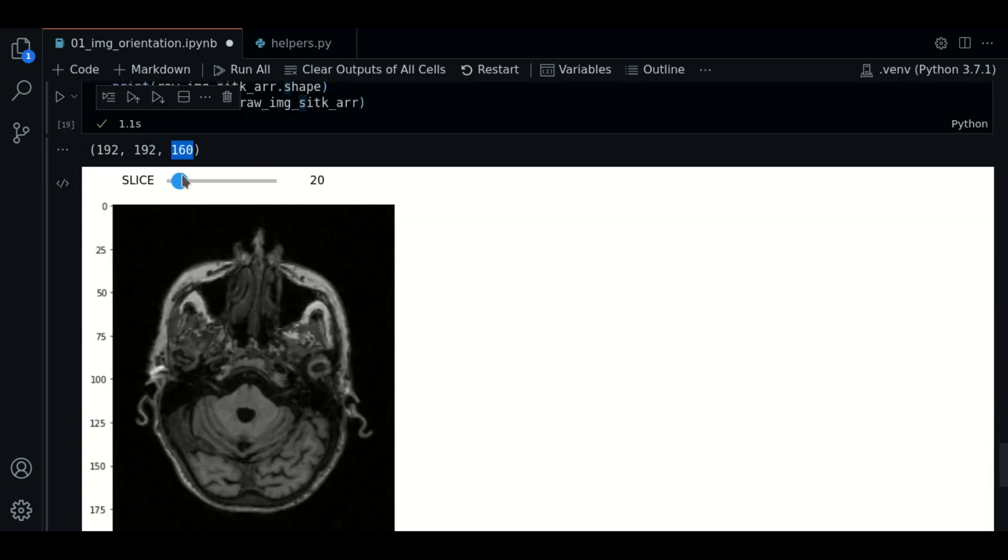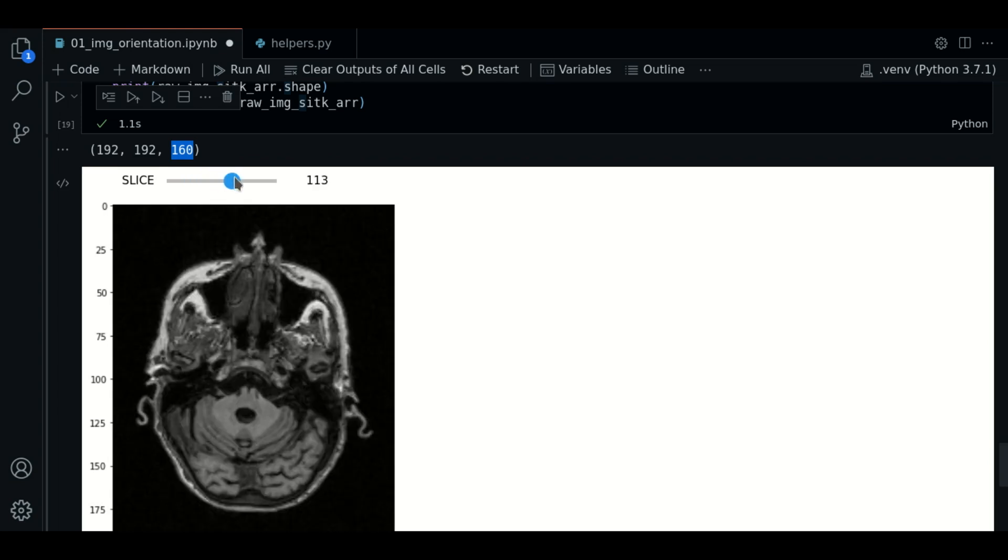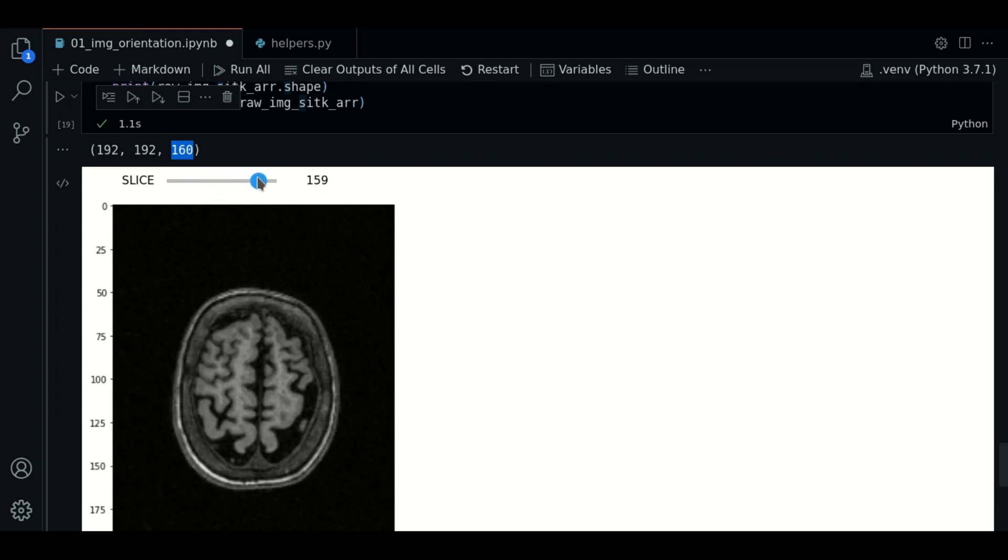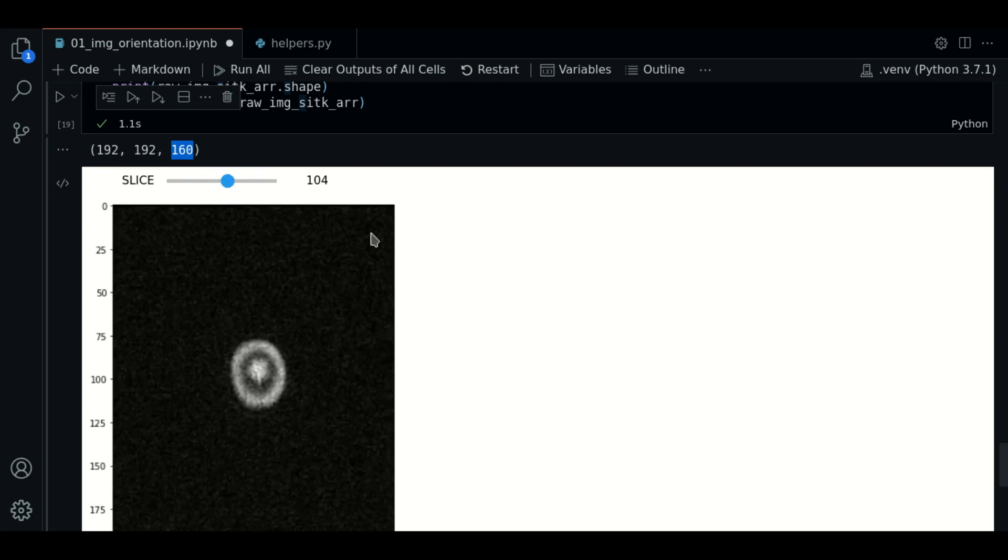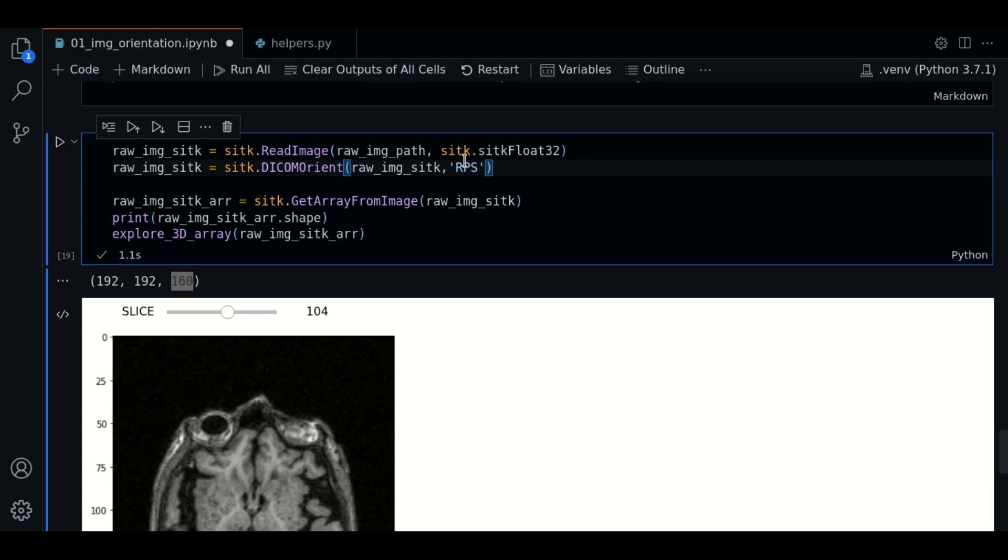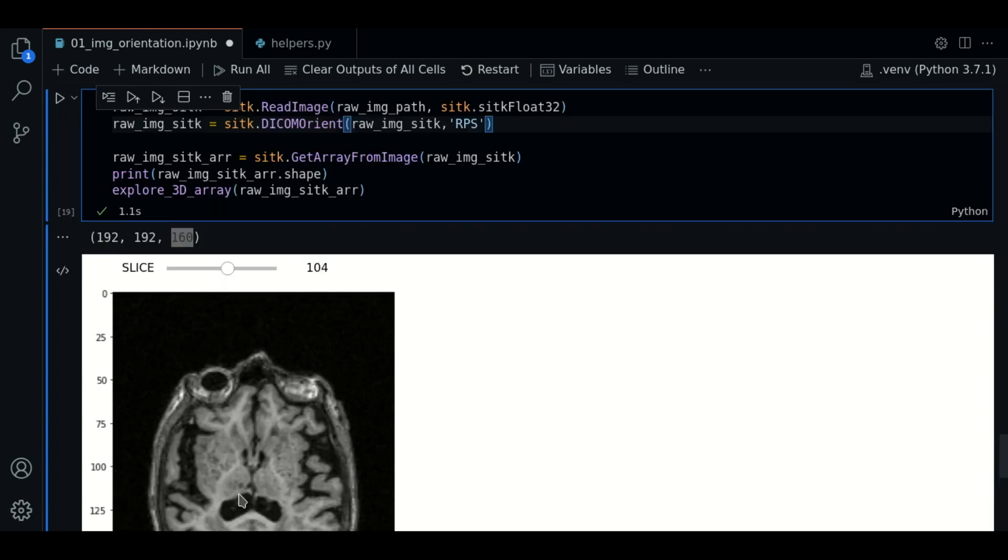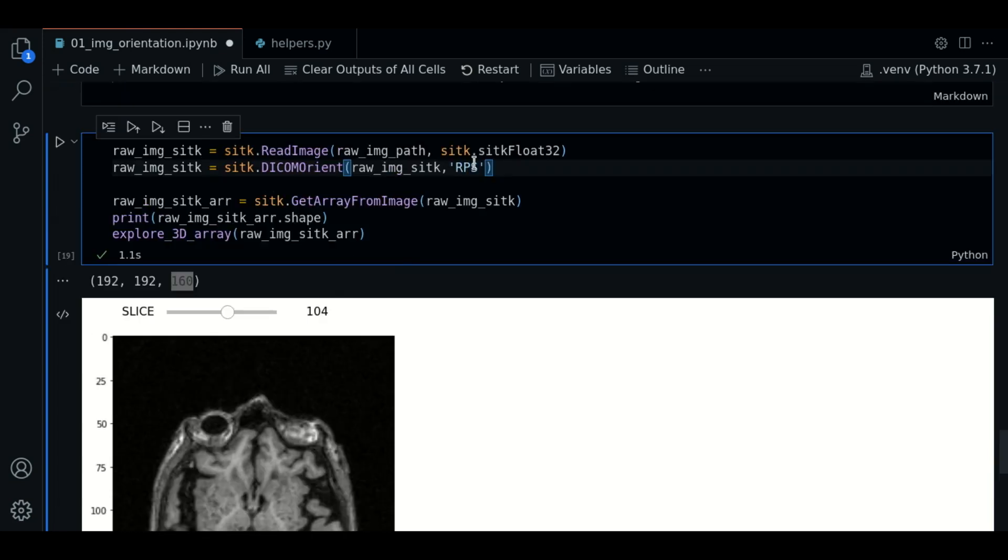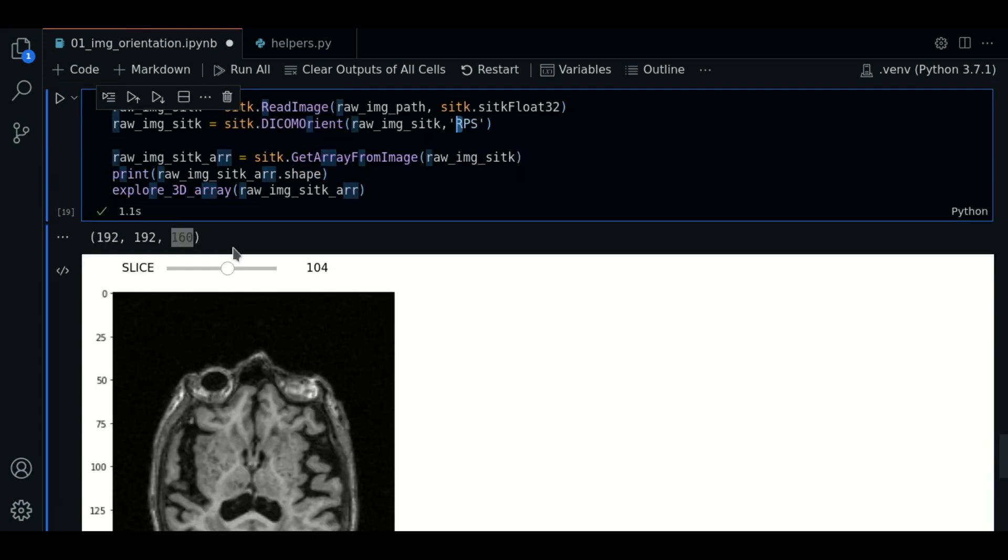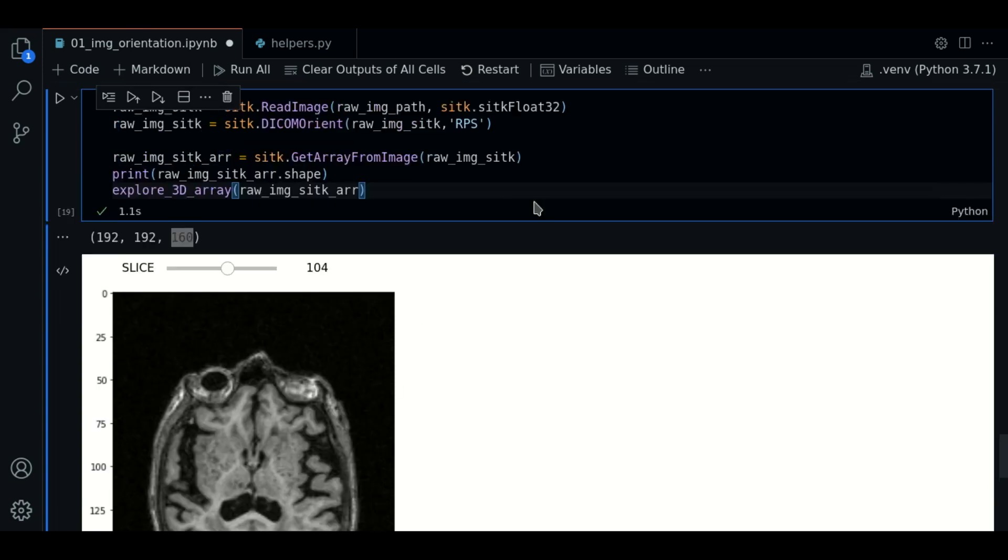The S means that we are going from inferior to superior. The P means that we are going from anterior to posterior in the two-dimensional plot. And the R means we are going from left to right in the two-dimensional plot.